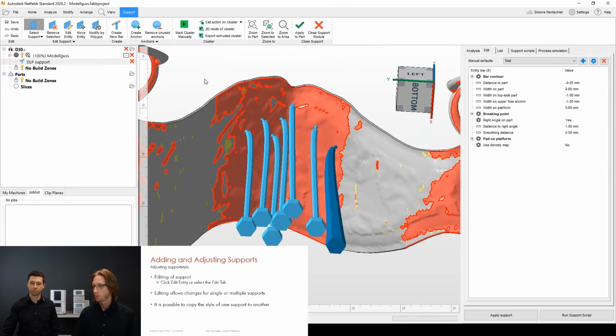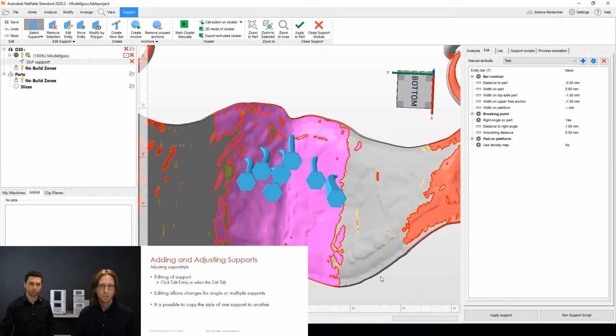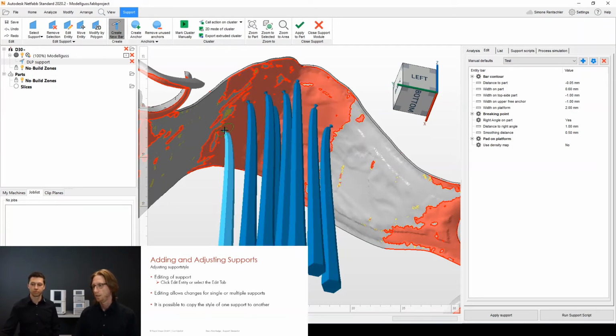Or what you can also do is you can just create a frame around all of these, and then you just go back to the edit button over there and you say I want to load the test set to this selection. Let's see what we got here. Perfect, so this is what we want to have. In addition to that, if you just want to create another bar, you will see that it is already using the latest set. So this is really nice and a handy tool for using the support generator.